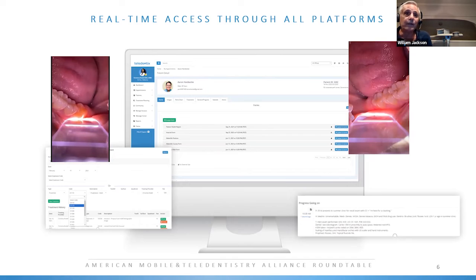You know, we have the ability to have forms. We have the ability to take notes. The forms actually are customizable. And so many people who use teledentistry are mobile, and people that are mobile need forms literally for every location that they go to. So we have very customizable forms.